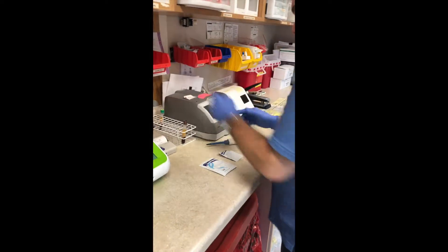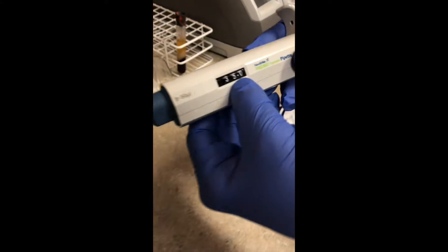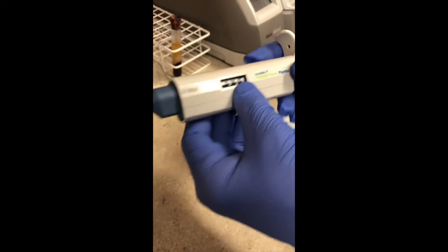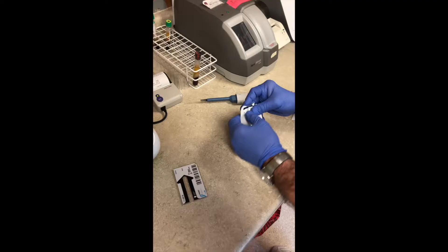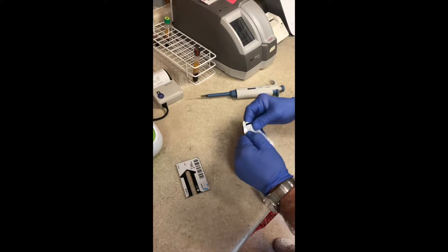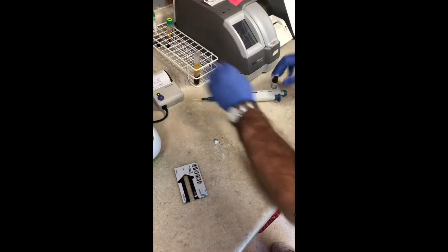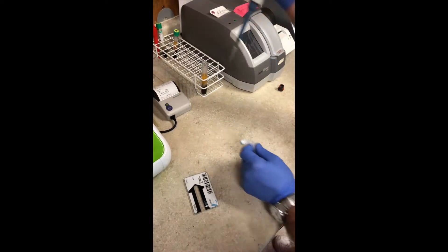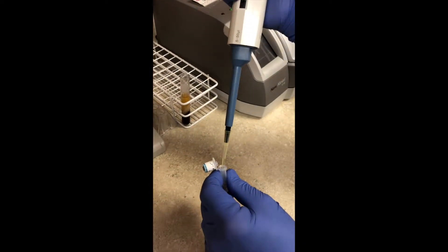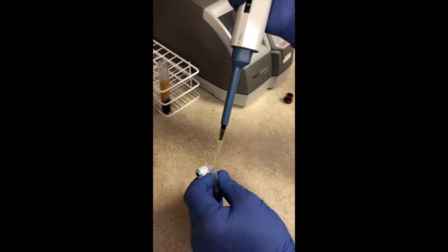After it's spun, go ahead and put your pipette tip on. Your pipette needs to be set at 35.0 ULs. Take your warmed cassette and vial out of the foil and wipe off the tube. You're going to put two pipette pulls into the vial — push down all the way, suck up your serum, push to the first stop. Do that one more time and push to the first stop.